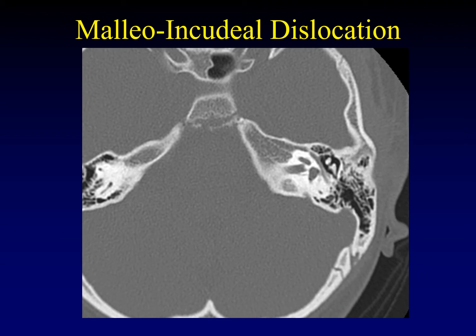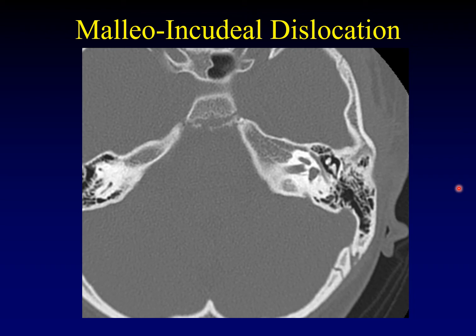Remember that when dealing with longitudinal fractures running through the middle ear, the ossicles are at risk. Find the ice cream cone — the normal malleoincudal relationship — and make sure the ice cream is on the cone. Here's an example where the ice cream has fallen off: the head of the malleus has fallen off the body of the incus. There should be just a barely perceptible line of medium gray between these two bones. Seeing air between them is absolutely abnormal — this is malleoincudal dislocation. Incudostapedial dislocation can also occur, but malleoincudal dislocation is far more common.